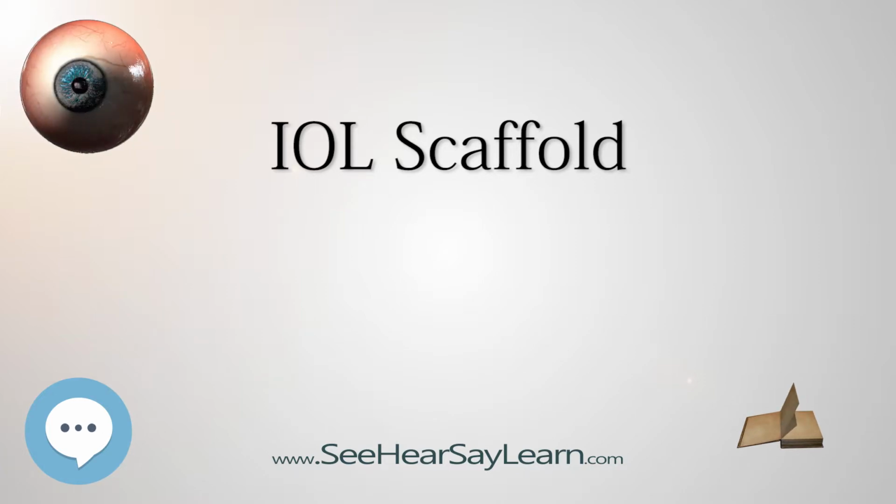History: intraocular lens scaffold technique was introduced by Dr. Amar Agarwal in 2012. He used this technique in a case which had posterior capsular rupture during a phacoemulsification procedure. Indications: the technique can be used for intraoperative nucleus removal during cataract surgery, phacoemulsification, removal of lens dropped on the retina, Sommering ring removal, intraocular foreign body removal, and IOL explantation.